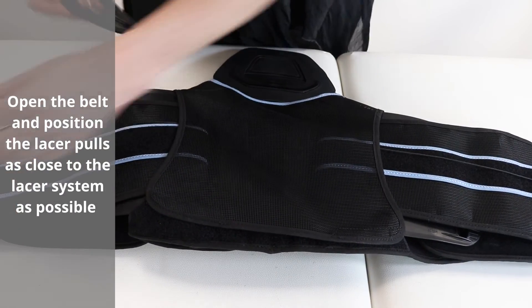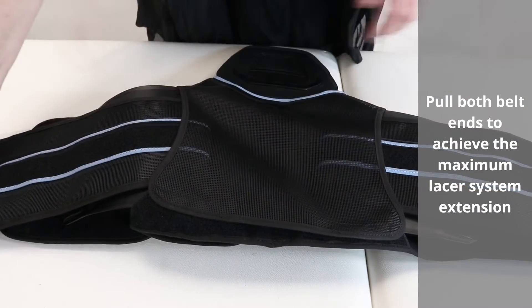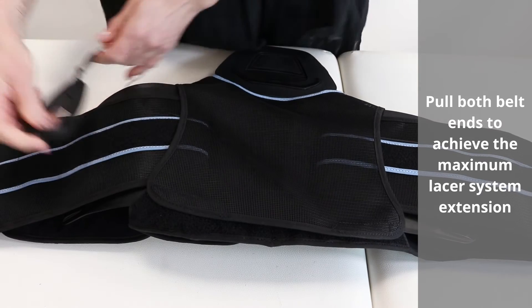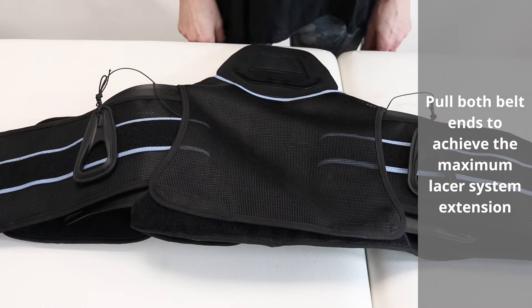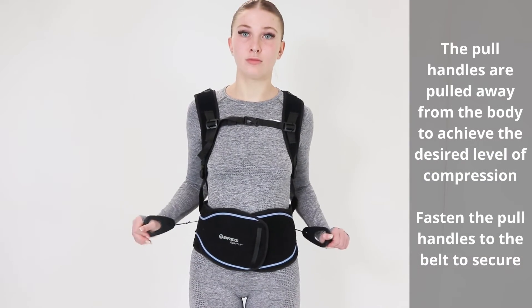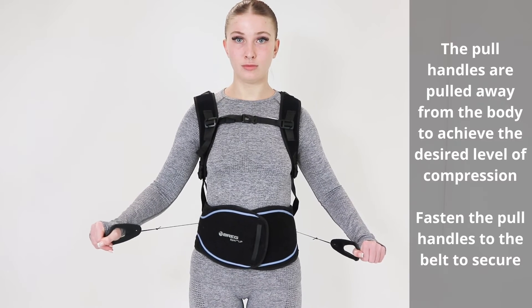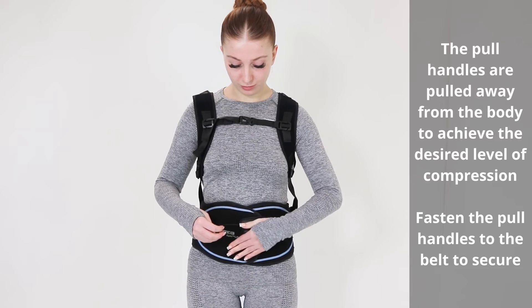Open the belt and position the lacer pulls as close to the lacer system as possible. Pull both belt ends to achieve maximum lacer system extension. The pull handles are pulled away from the body to achieve the desired level of compression. Fasten the pull handles to the belt to secure.